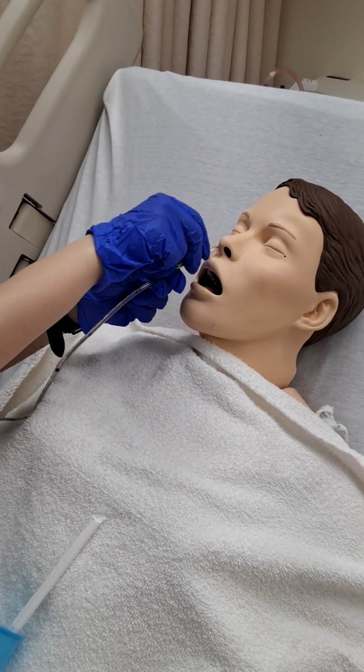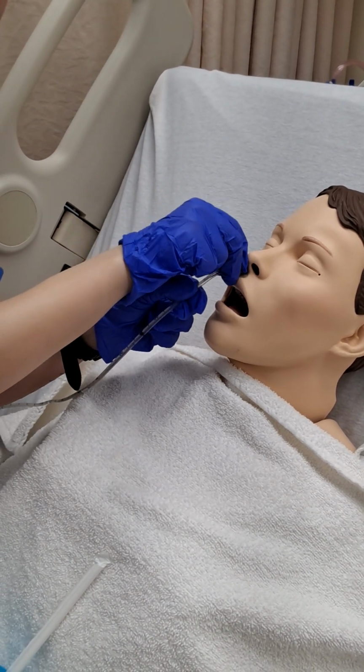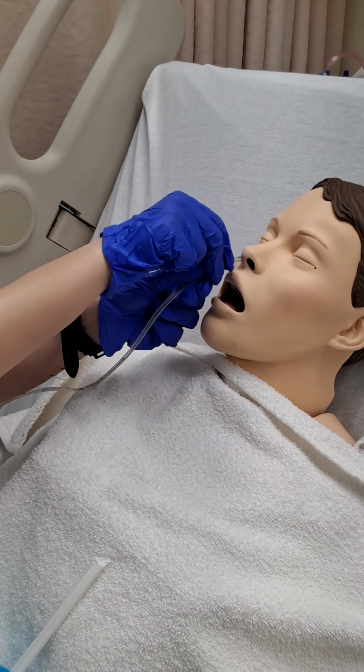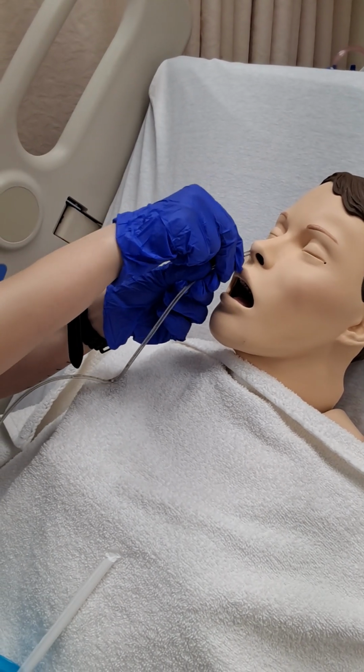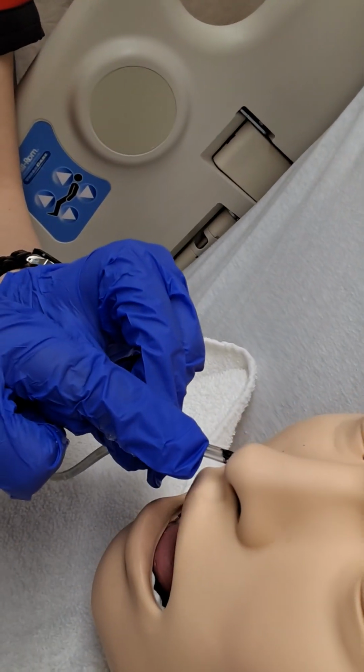You got it. We're almost there. He's not gagging. He's not cyanotic. He's not coughing excessively, so I'm going to continue to put the tube further into him. Okay, so now we're at the 52 mark. You did really good. 52.